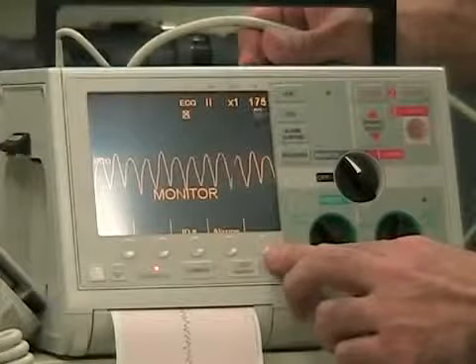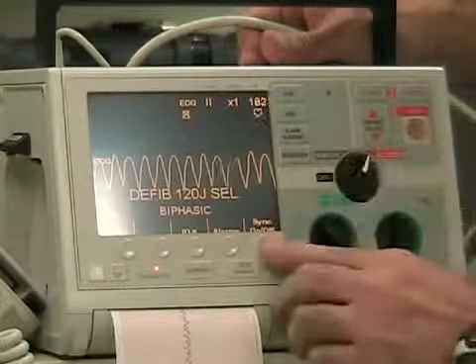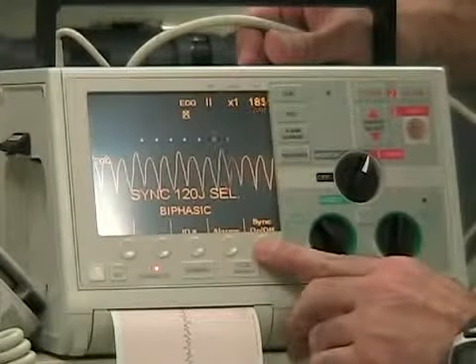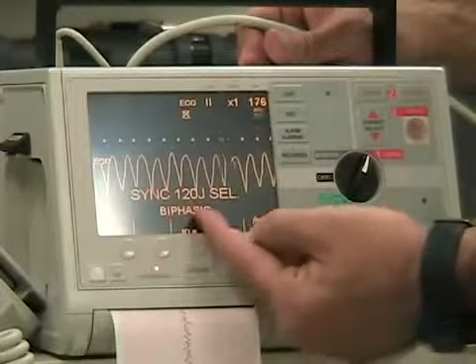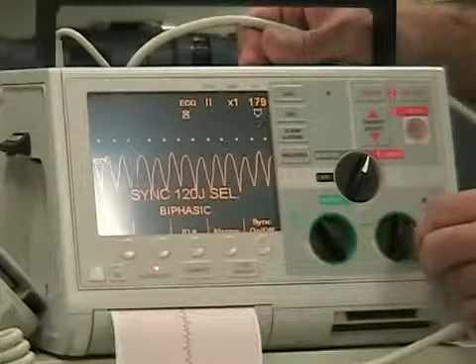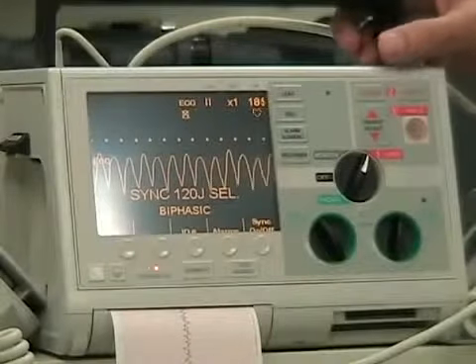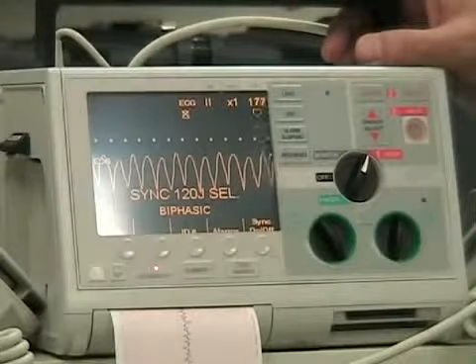Since he's unstable, since he's not pulseless, we're going to use, that's right, synchronous cardioversion. So Dr. Jacob is going to make sure that he presses the sync button before we fire. Because in this case, we have time for the pads to read and fire at the right time. You can see from the arrows, and you can see from the sine wave that we are now synchronized, so we're okay to fire.